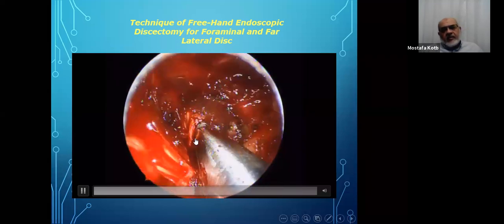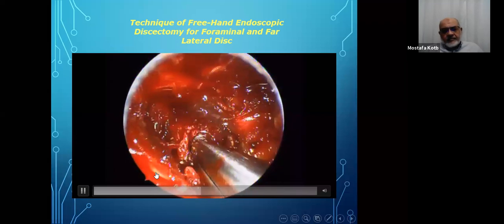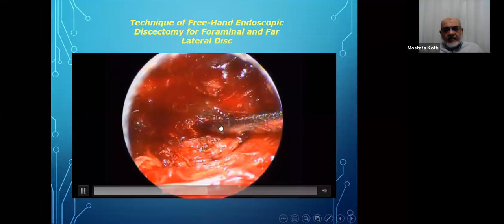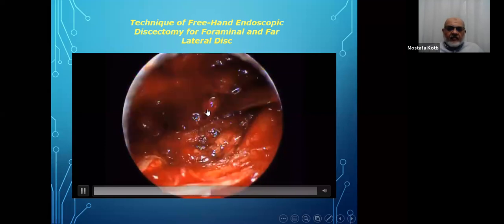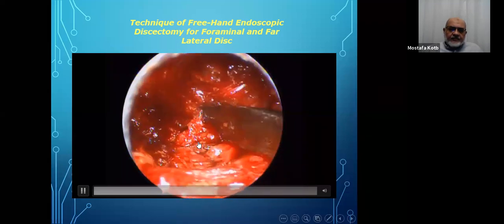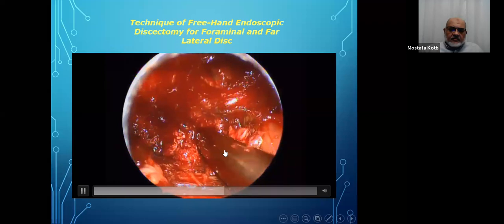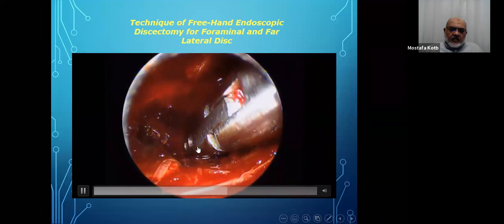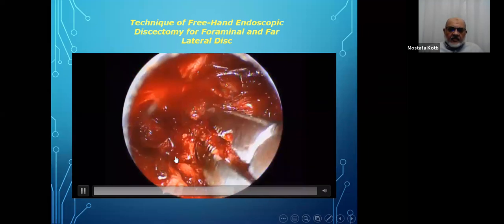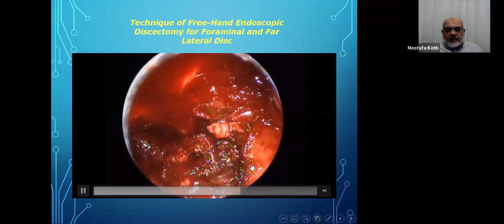You continue by using the punches to take out the disc material. And you use the dissector to take out the escaping fragment from the foramen, as you can see here. And just as I'm saying, you continue taking out your disc until you fully decompress the foramen and the traversing root.